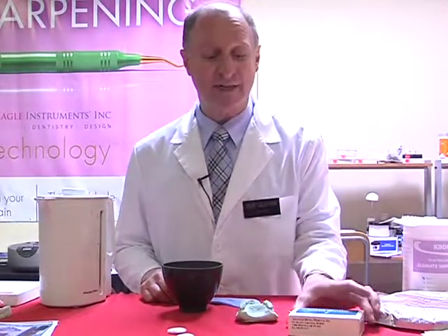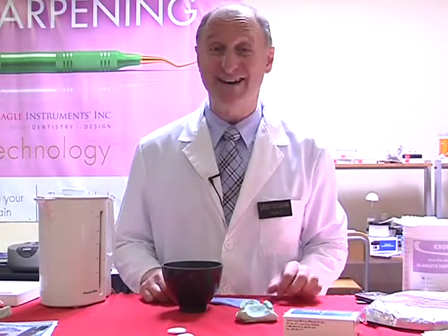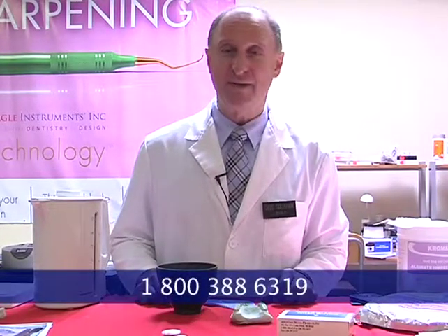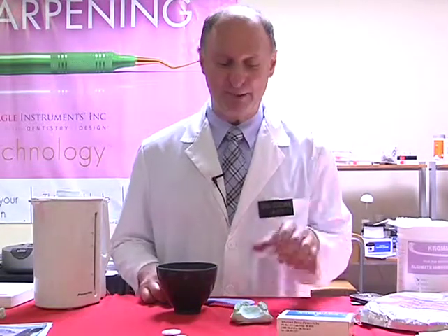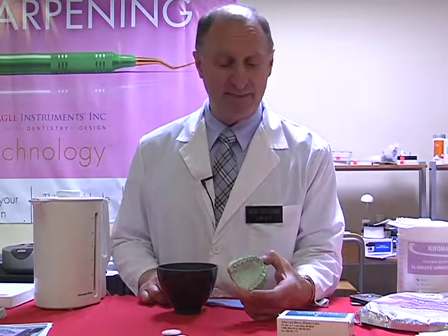And you can actually get samples of the temporary crown matrix buttons from the company called Advantage Dental by phoning this number, 1-800-388-6319. They'll send you a sample, so let them know. So, normally we'll be using this directly in a patient's mouth.